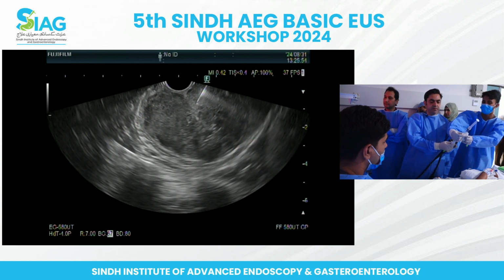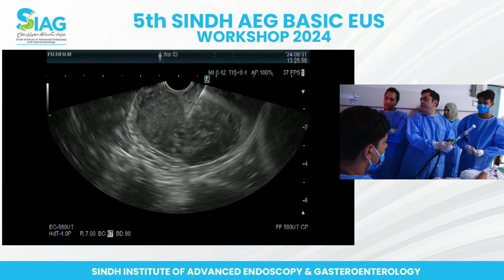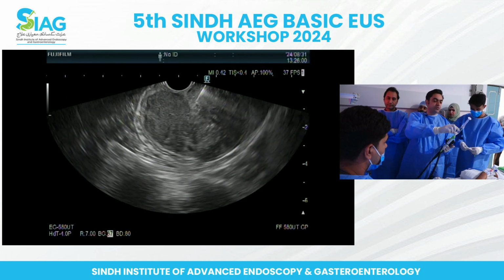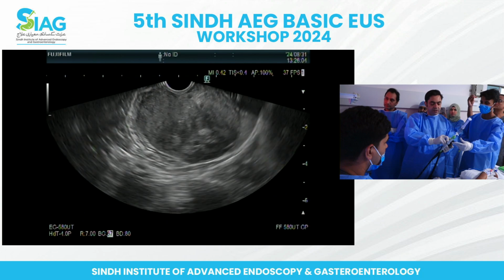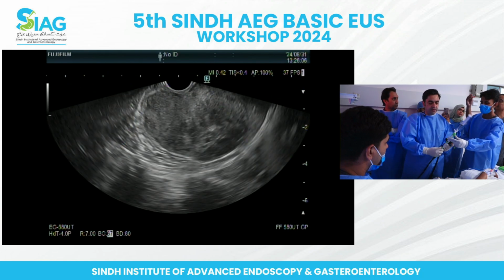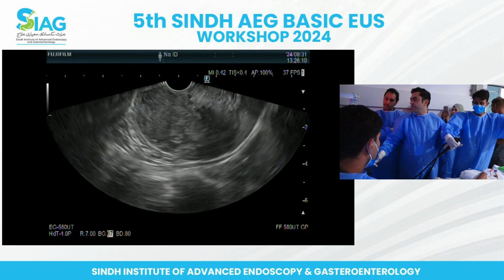Yeah, so I just put suction on, a few quick jabs while the suction is on, and that should do the trick of getting the sample. So I've locked the big wheel up, and we'll just move the needle. So we might switch to the other room, Shahzad. Yeah, okay.